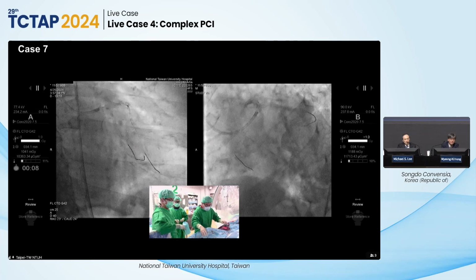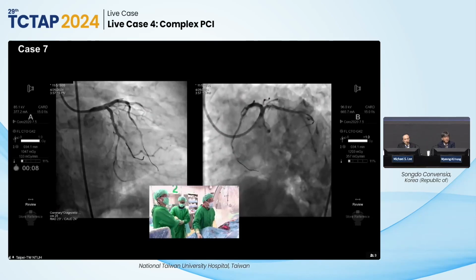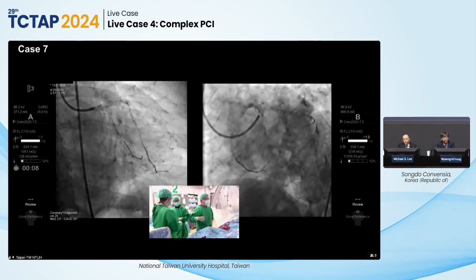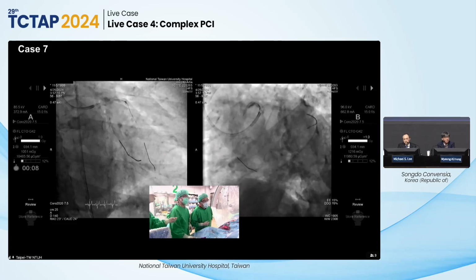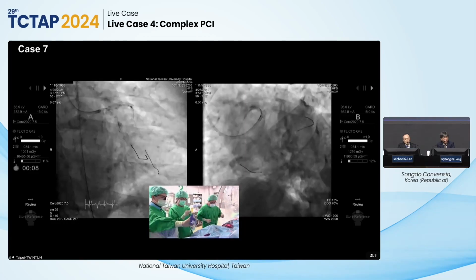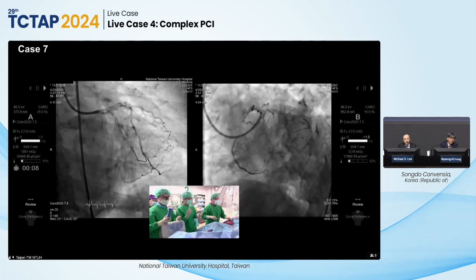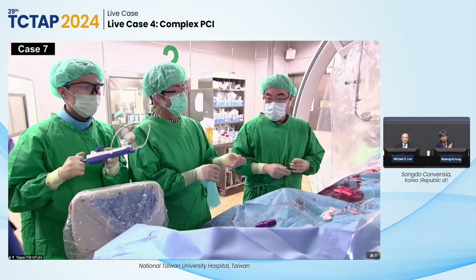Well, I will just show you right now before we did our POT. The POT is an easy part. Okay, so that's going to be our semi-final result. Okay. That's beautiful. Okay, very good. Okay, thank you guys, really appreciate your patience and contribution. Thank you. Great job. Okay. Thank you. Thank you.